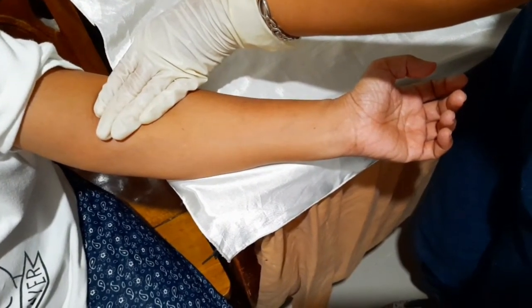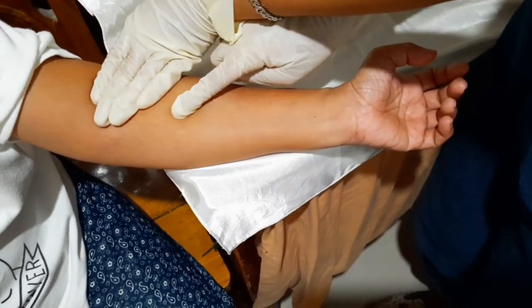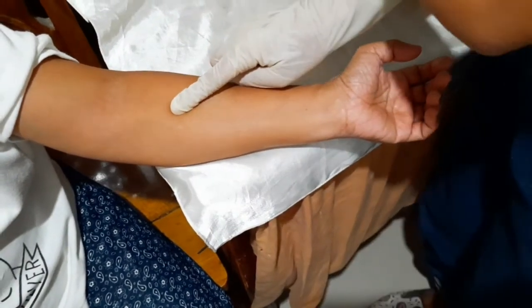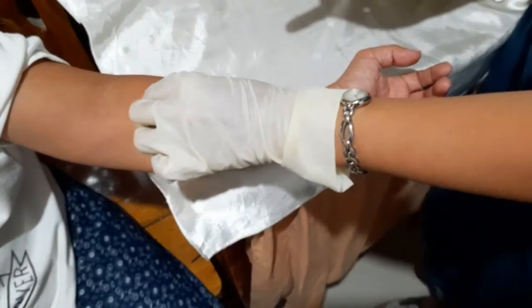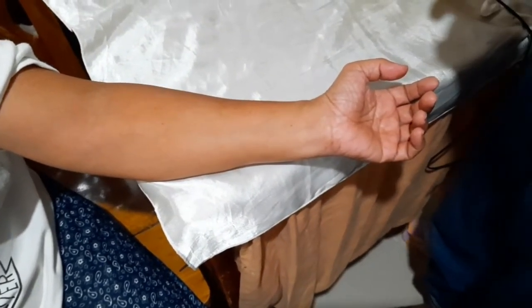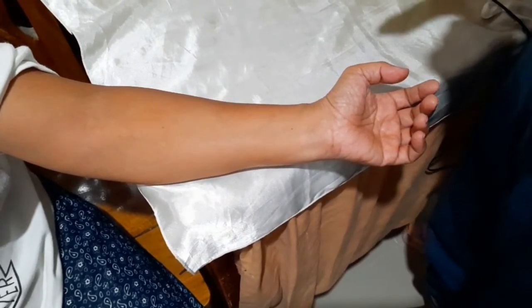Then about this point, you're gonna wipe it. Wait for it to dry. Don't blow on it or don't wave your hand over it. Just wait for it to dry.